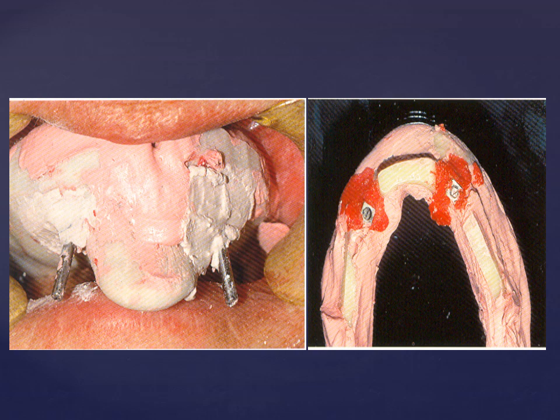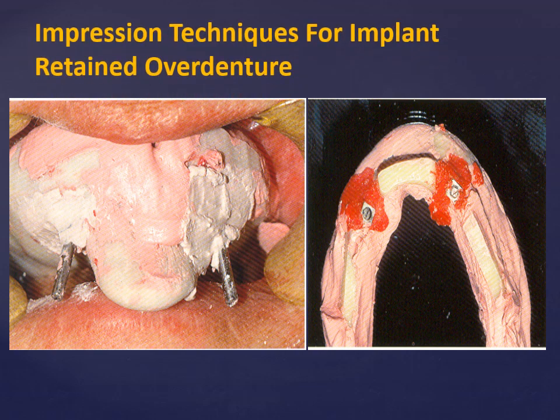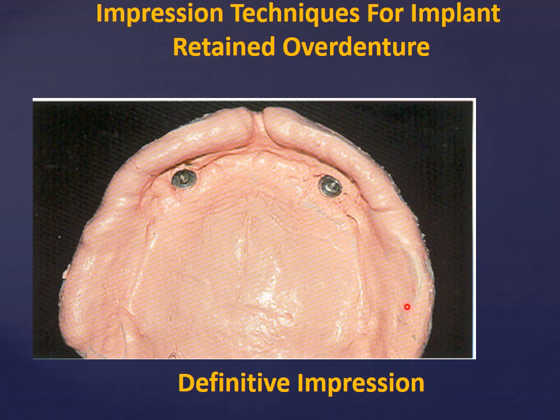After that, we can take the impression and remove all this equipment in one piece after setting of the impression material.